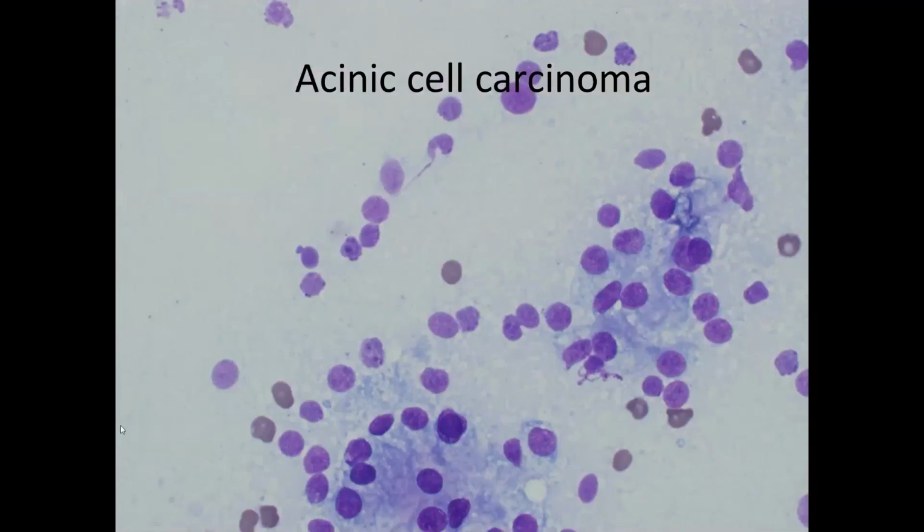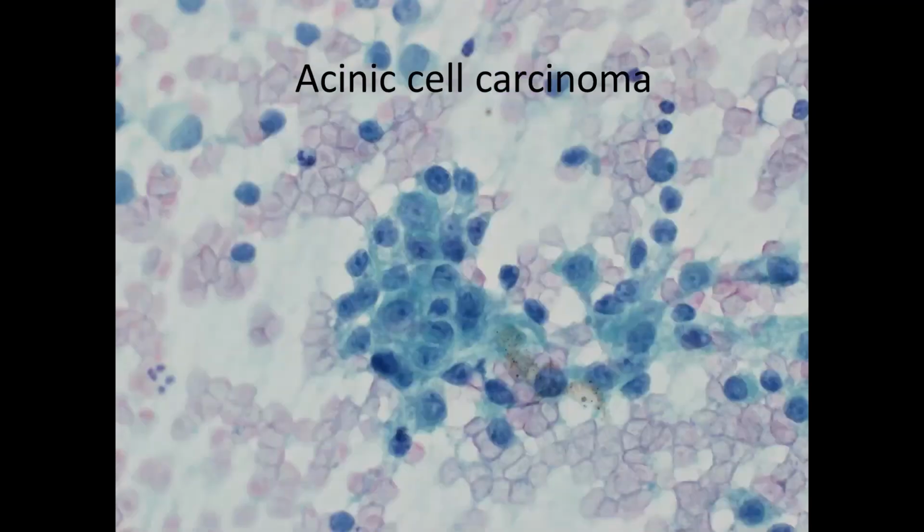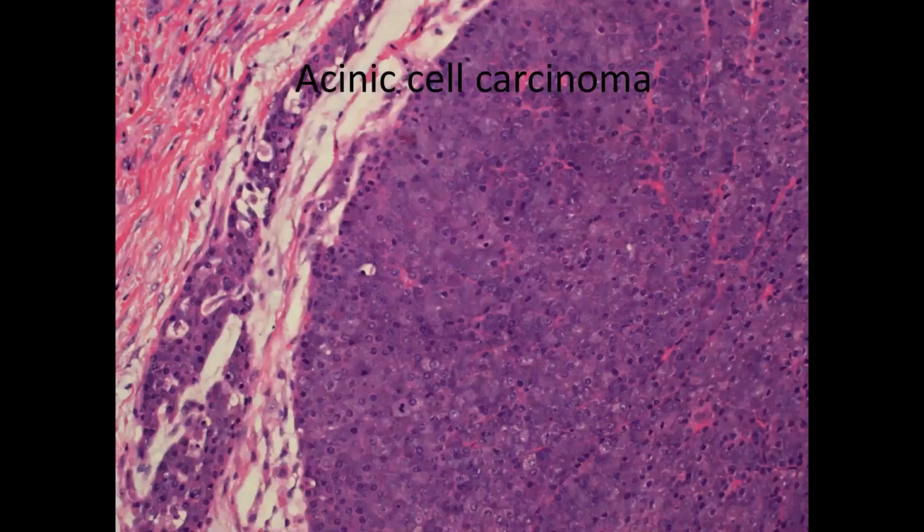Again, you can appreciate here the syncytial sort of cytoplasm, the naked nuclei, the combination of granular and vacuolated cytoplasm. Again, a striking resemblance in my mind to renal cell carcinoma. And again, you can appreciate the degree of nuclear atypia is much greater than in those other tumors. And again, on resection, you can appreciate this is a nice acinic cell carcinoma. You can see, again, this abundant, coarsely granular basophilic cytoplasm.